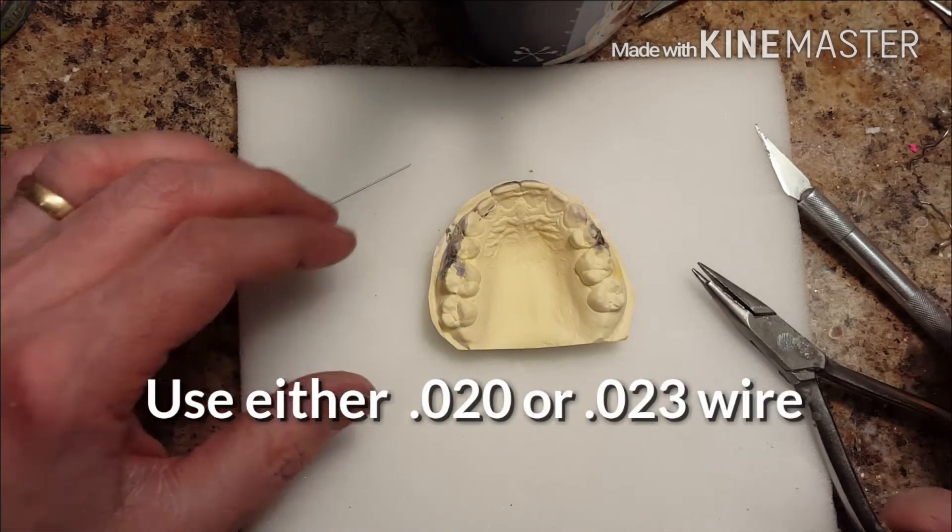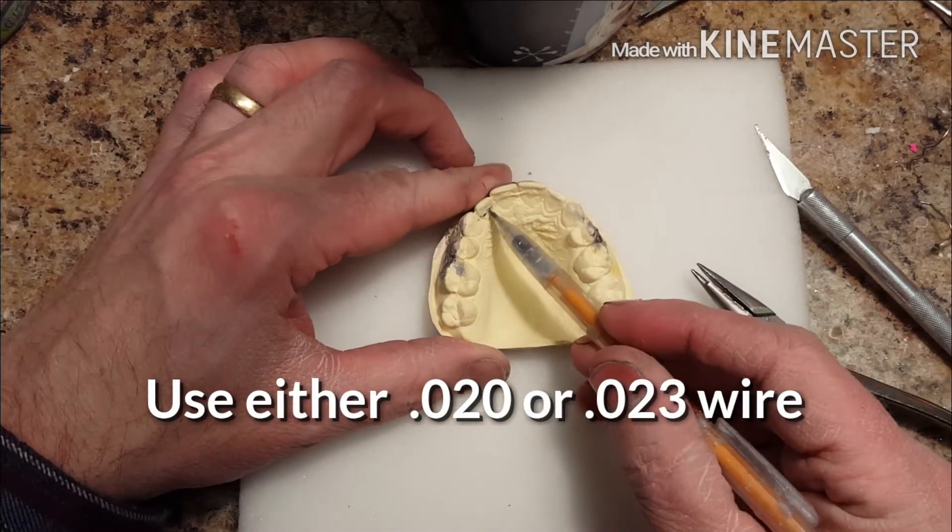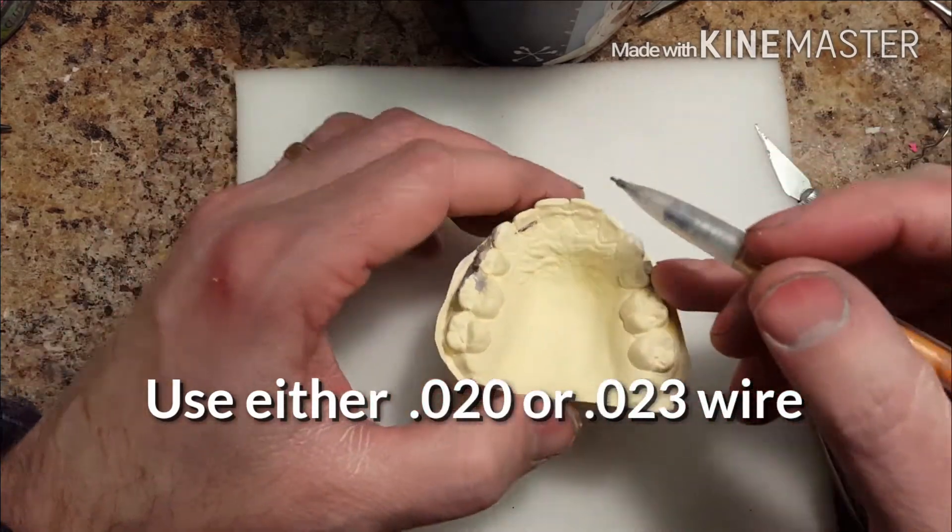Hi, this is Steve Zara. I'm going to show you a quick lesson on how to make an S-Spring.